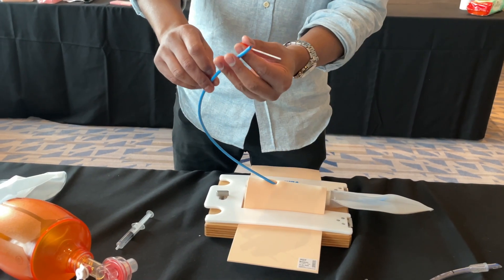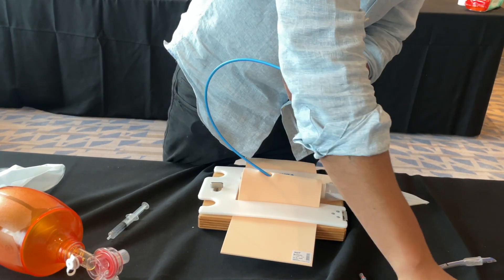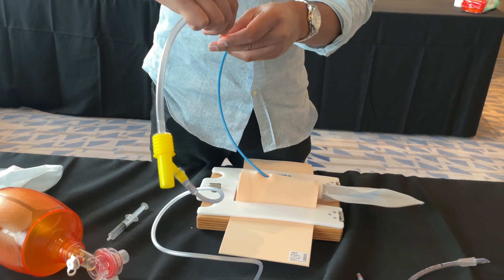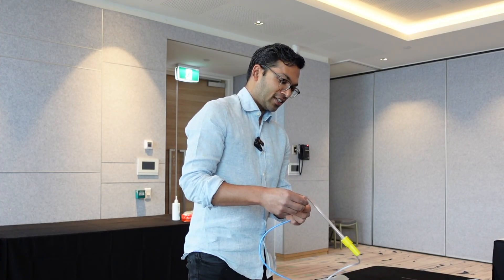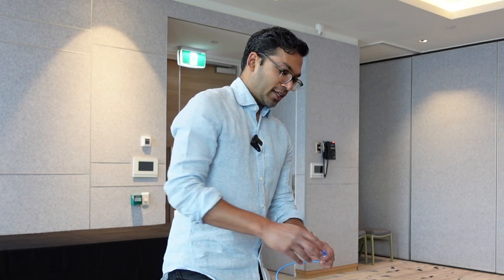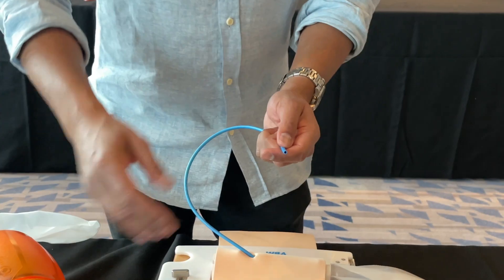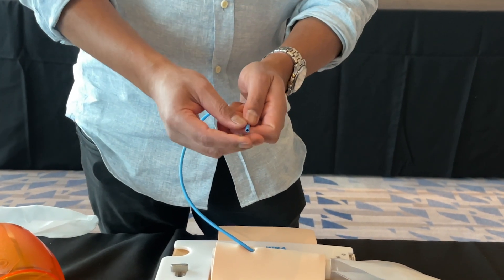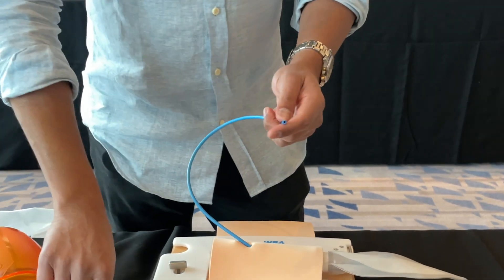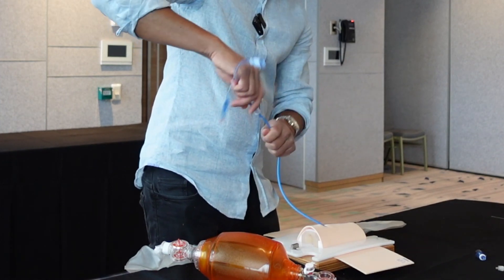If you don't have a rapid fit connector, you can use a 14-gauge cannula, insert it, and attach your rapid oxygenation device for some level of jet ventilation oxygenation. However, even though the rapid fit approach is taught by the Andrew Hurd algorithm, if you don't have the device ready or your bougie doesn't have a hole, you may just want to railroad the size six tube as quickly as possible to give your patient a definitive airway.